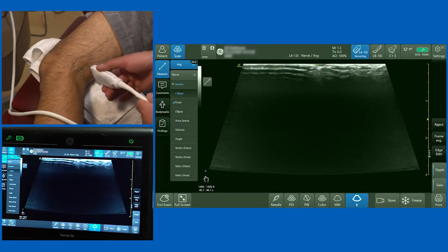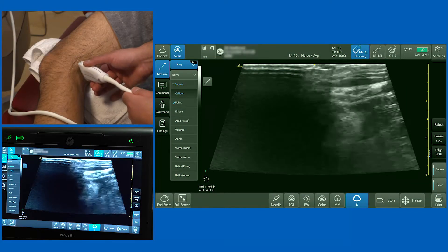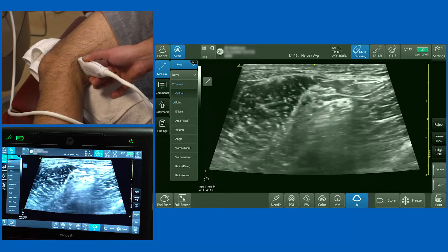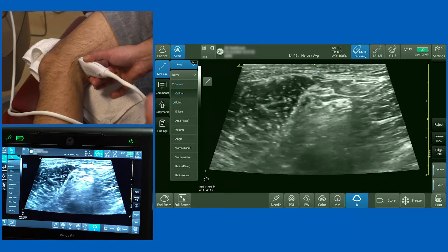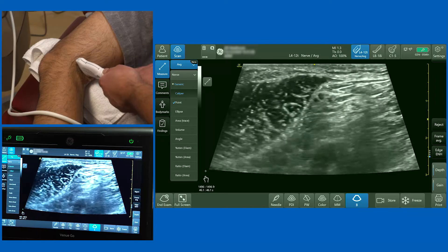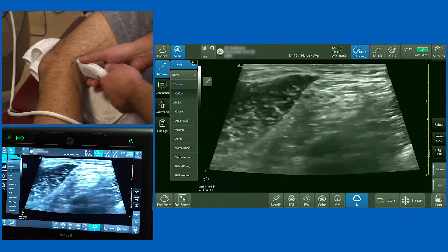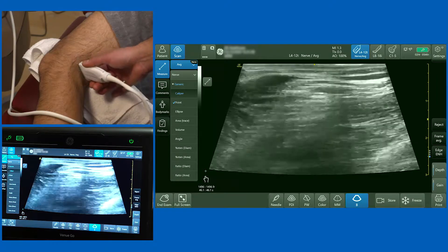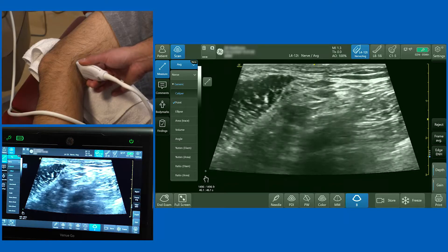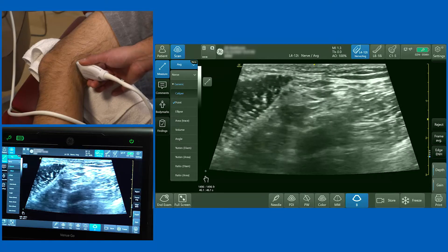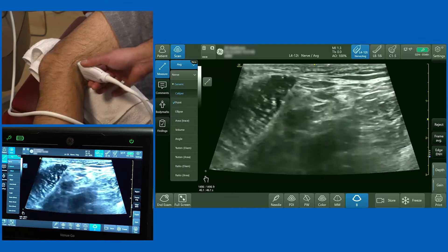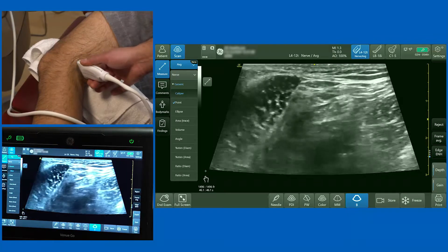We're now going to demonstrate the popliteal approach to the sciatic nerve block. The patient is in the lateral position with a blanket or towel between the knees to support them. I'm going to use a high frequency linear probe with the virtual convex function on, initially starting at the popliteal fossa.